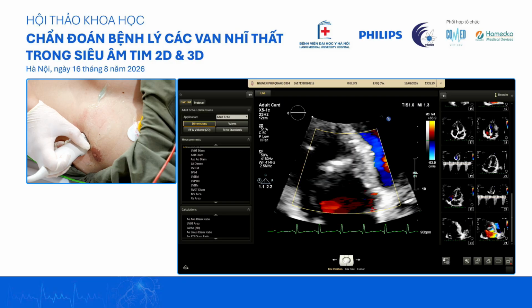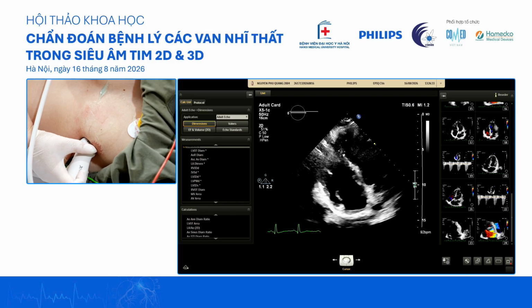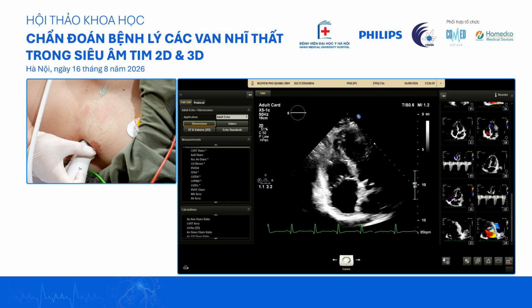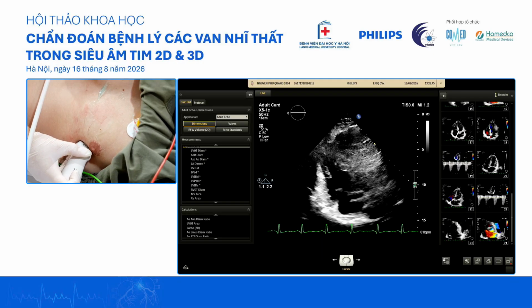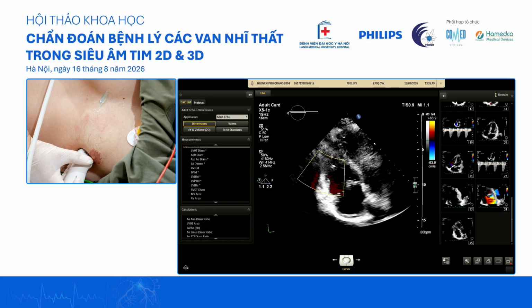Chúng ta cần phải điều chỉnh đầu dò một chút, tại vì cấu trúc ba chiều có thể cái dòng hở nó không xuất phát từ vị trí mặt phẳng này mà xuất phát từ các mặt phẳng khác, cho nên cần phải điều chỉnh một chút. We will also do a RV focus view. So this will also give us our RV function. Mặt cắt tập trung thất phải giúp đánh giá chức năng thất phải.